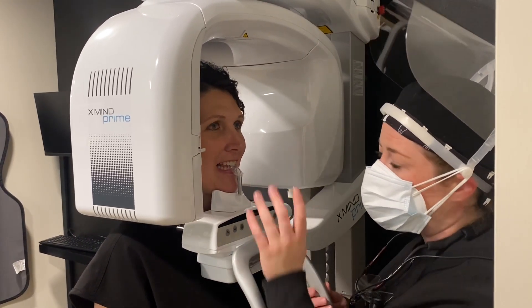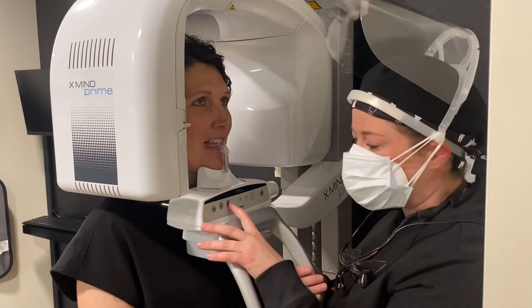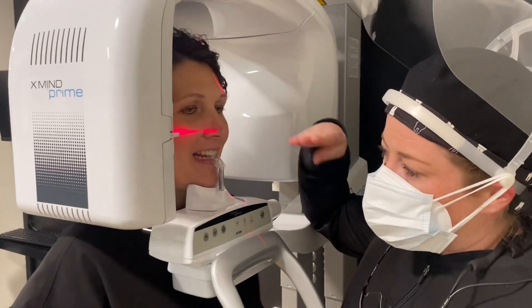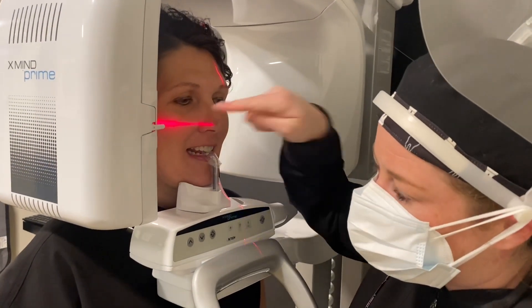She's looking great. There are a few other planes you want to make sure are aligned. To do this, turn on your light. Make sure your Frankfurt plane is parallel to her occlusal plane and runs through her tragus.